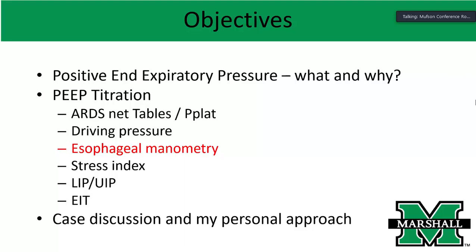If it went up by 2, maybe you could give it some time. But if you increase the PEEP by 2, 3, or 4, and then the plateau pressure goes up by 8, for example, then that tells you that the lungs may be too stiff, and he's not responding very well to increasing your PEEP.